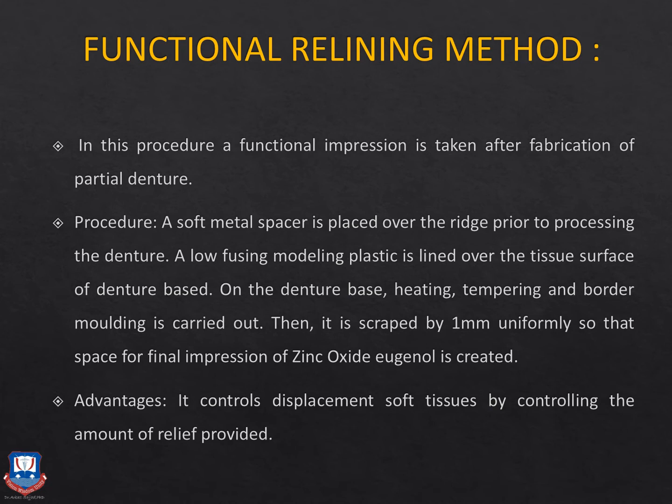The motive behind this is that even though the impression may be captured accurately and the cast partial may be fabricated, it is often seen that after a few days or a few weeks there will be settling of the denture bases, and the patient may complain that the denture base is slightly loose and unstable. So the functional relining technique ensures that there is intimate contact of the denture base with the underlying tissues after the entire denture fabrication steps have been completed.